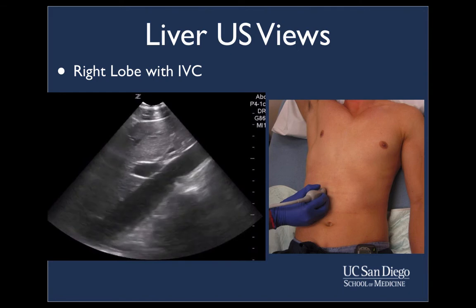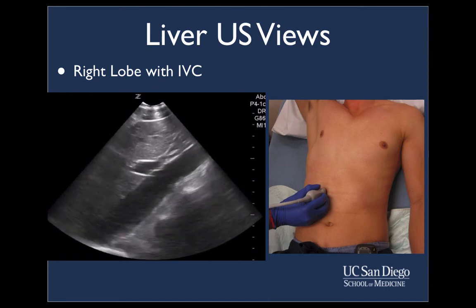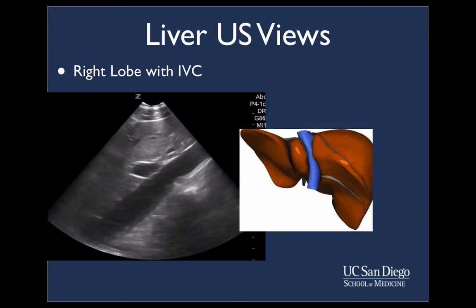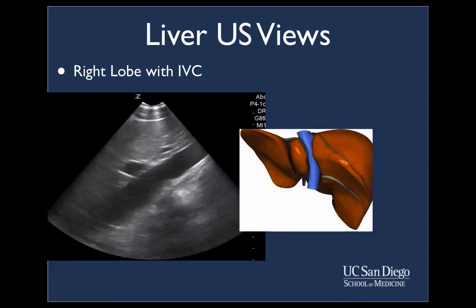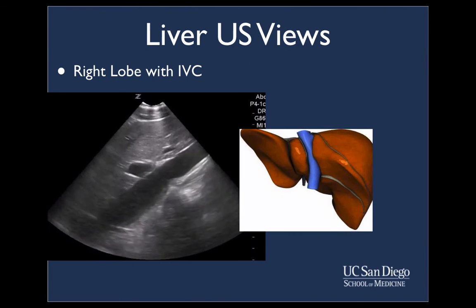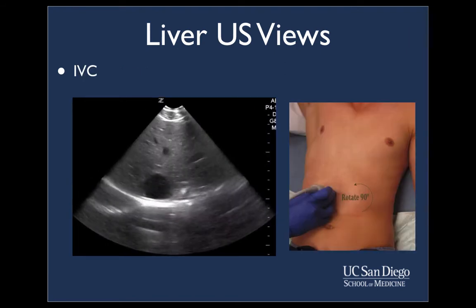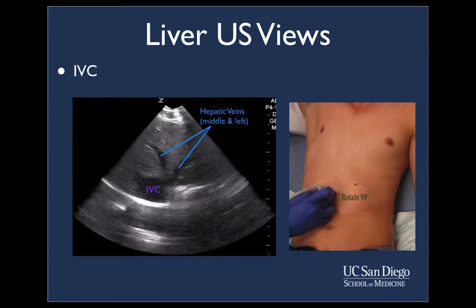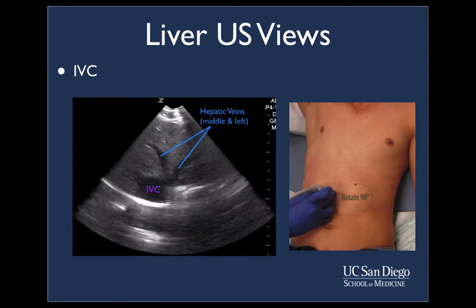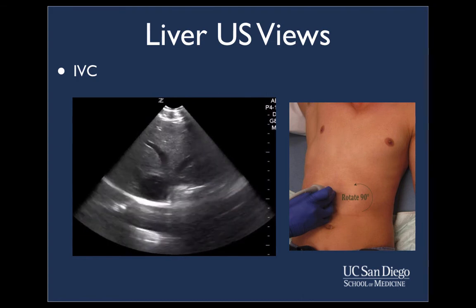The next view, while still holding the probe longitudinally and scanning more medially, reaches the margin of the liver's right lobe just before the left lobe begins. At this point, the inferior vena cava, or IVC, is typically visualized in its longitudinal axis. Note how the IVC becomes intrahepatic prior to crossing the diaphragm. The probe may be rocked upward towards the diaphragm to visualize the IVC crossing into the right atrium. Once the IVC is evaluated in the longitudinal view, the examiner may rotate the probe 90 degrees to visualize the IVC in the transverse view, allowing for visualization of the hepatic veins, which drain into the IVC. The hepatic veins have smooth, thin walls, in contrast to the portal veins, which have thicker, bright, or hyperechoic walls.